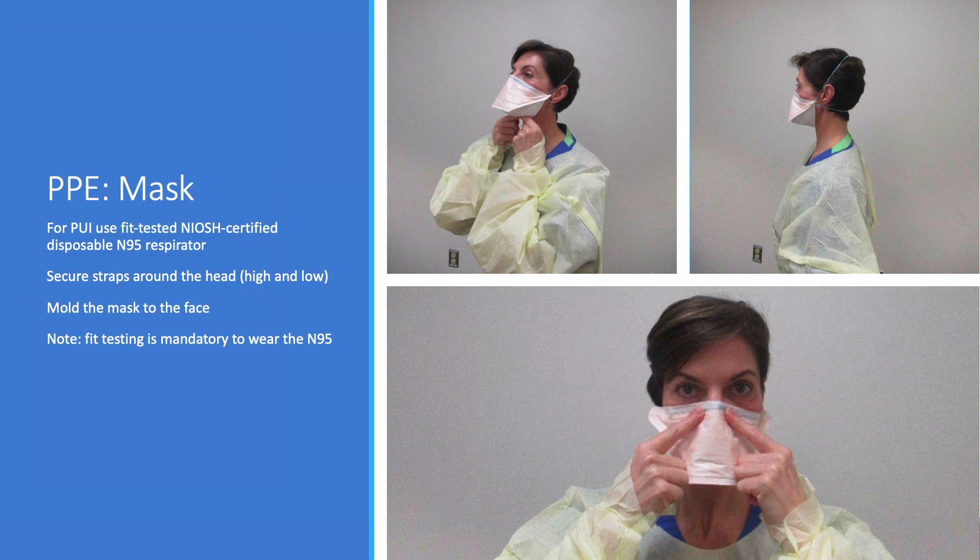Next comes the mask. For patients under investigation for airborne illnesses, the CDC recommends using a NIOSH-certified respirator like the N95. This means you'll need to be fit tested to determine the right size if you haven't already done so. This is typically performed by placing a mask on the health care provider and a hood over the head. A substance like saccharin is injected into the hood — if you can taste the saccharin, the mask is not fitted well. The respiratory therapist here has placed the appropriately fitted mask on her face, secured the straps around her head, and pinches the nose of the mask so the form-fitting piece on top helps mold the mask to her face.